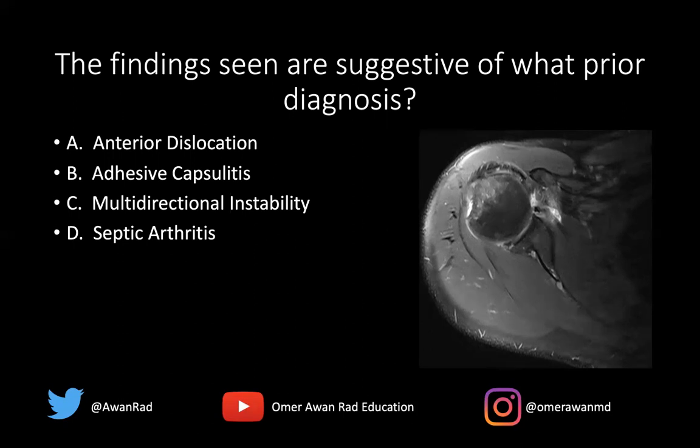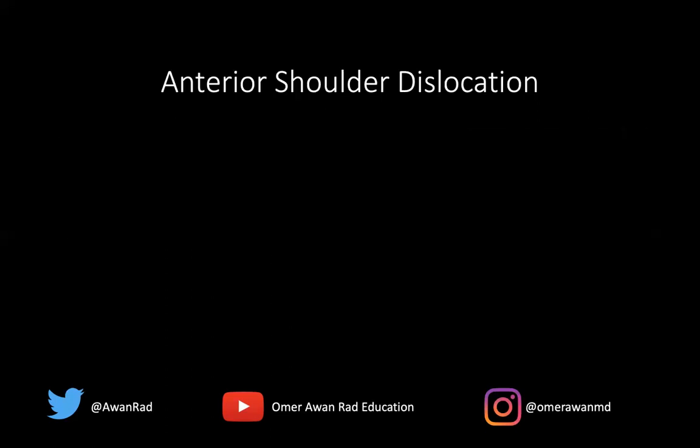Septic arthritis would present with full-blown infection, subchondral erosions, maybe a complex joint effusion, and bone marrow edema on both sides of the joint. We certainly don't see that here. So the best answer here would certainly be an anterior dislocation.